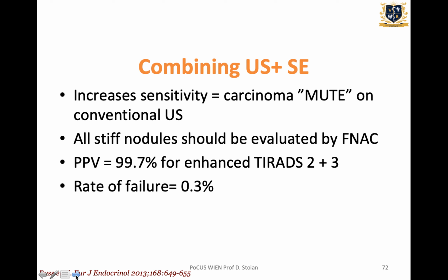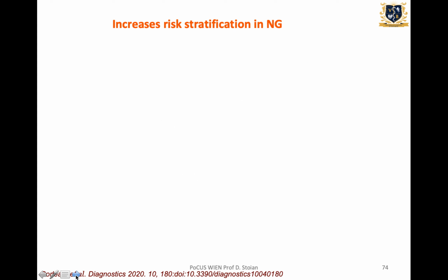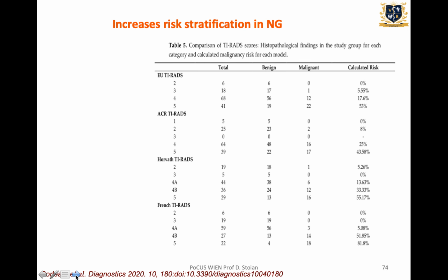It can reveal some mute carcinomas on conventional ultrasound, increases the risk stratification and nodular goiter.